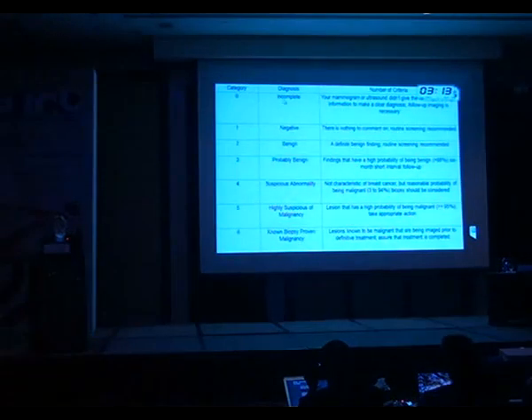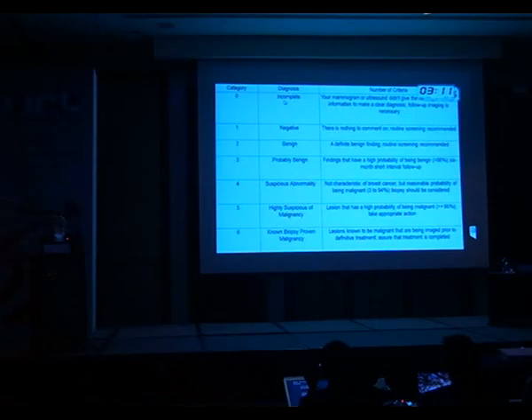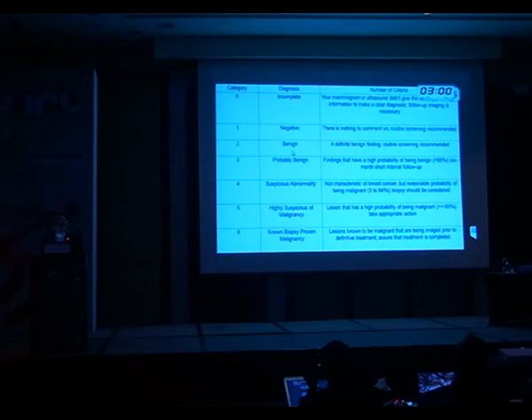Category 0 is when having an incomplete study, or the study is non-informative. Negative when having nothing in the mammogram, it's completely normal. Benign, when you can definitely say it's benign, 100% benign. Probably benign if the abnormality is like 98% benign, or for most of the benign solid lesions being first seen.